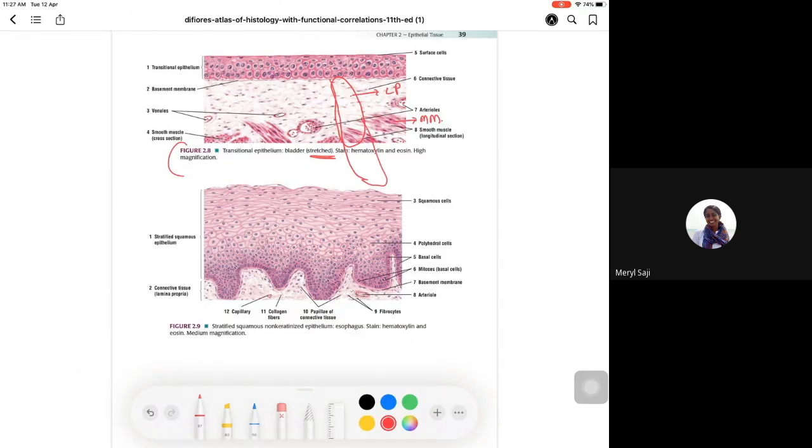In any bladder biopsy, whenever you see transitional or urothelial carcinoma, you have to see whether muscle is involved or not. Muscularis propria, okay, not the muscularis mucosa equivalent or the muscles of the blood vessels. Muscularis propria, because there is a treatment difference. If the tumor is not involving the muscularis propria, then it can be treated with intravesical BCG or intravesical mitomycin. But once the muscle is involved, they have to do cystectomy. So whether to preserve the bladder or not, pathology is very, very important.